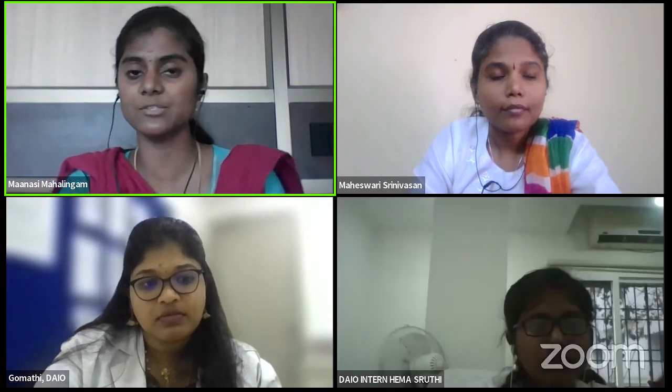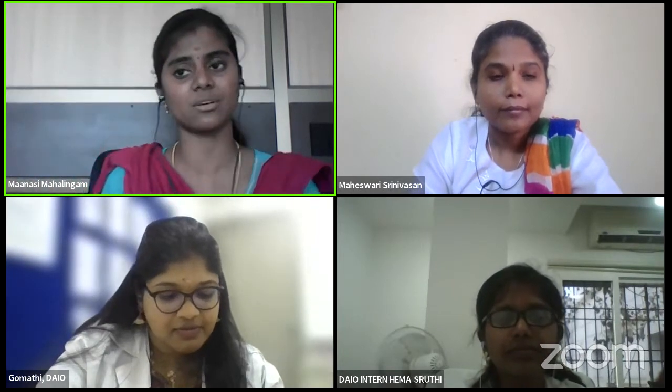FFA is time consuming, whereas OCTA is not. It takes just 2 minutes. For FFA, the physician has to give clearance, and if the patient is a heart patient, they should stop those medications. There are many more standard procedures before performing FFA and ICGA which are not required for OCTA. The patient will know the world of difference between these two because they need not go through this tedious procedure.